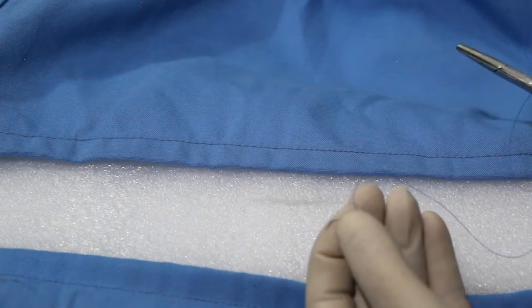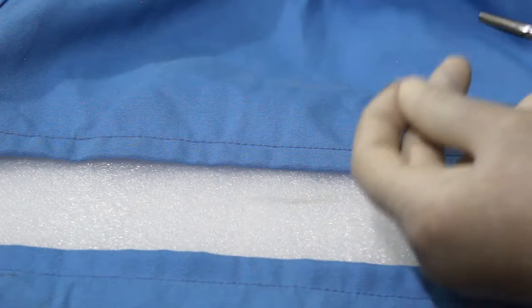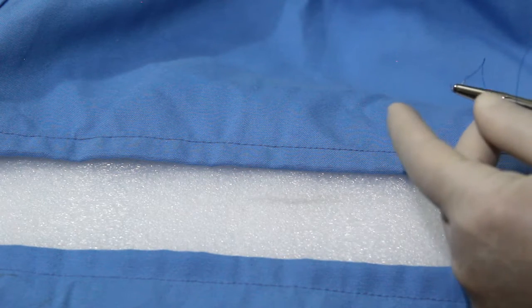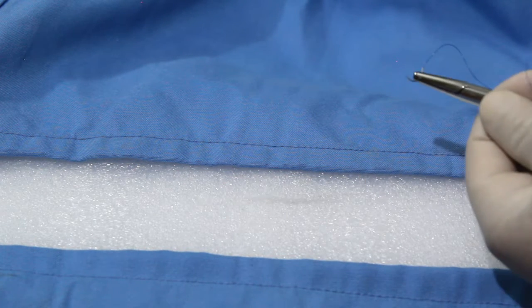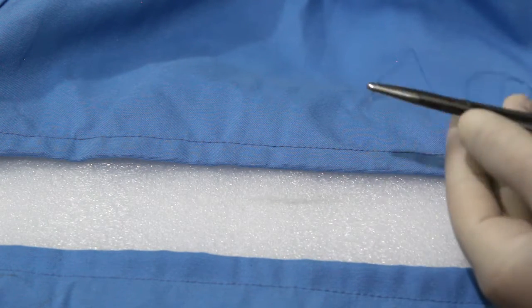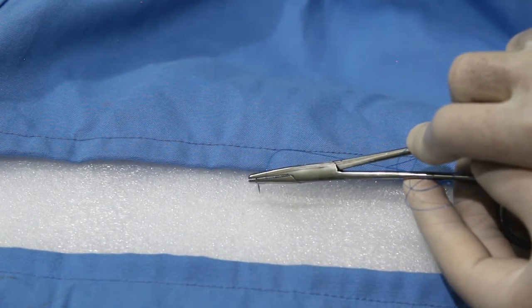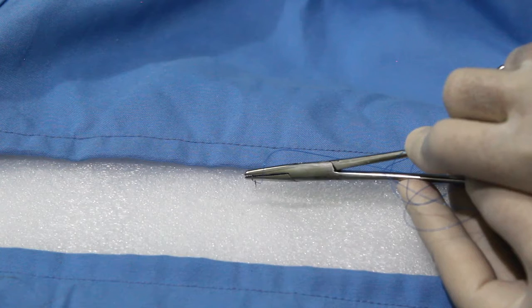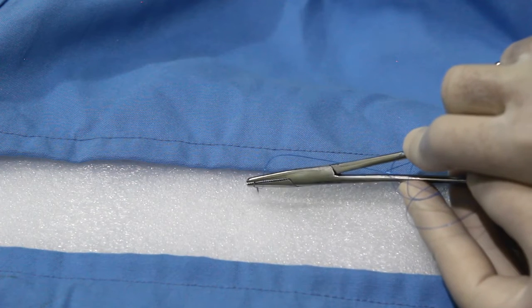There are some basic principles of suturing. Principle one: the needle should be grasped approximately two-thirds from the point and one-third from the eye. Principle two: the needle should always pierce the tissue perpendicular to its surface — not at an angle, always perpendicular.